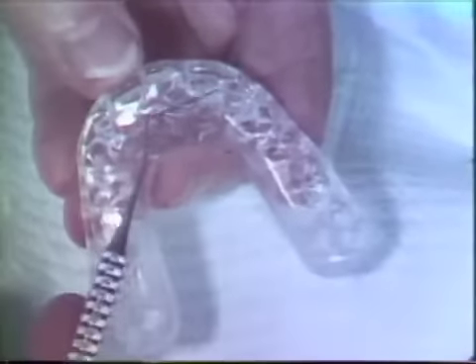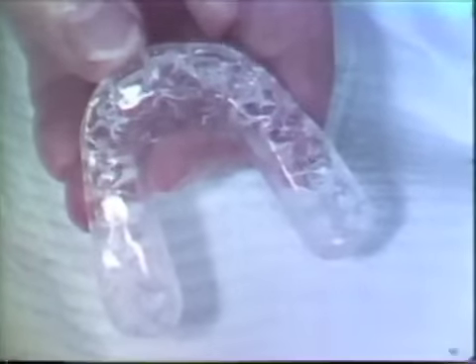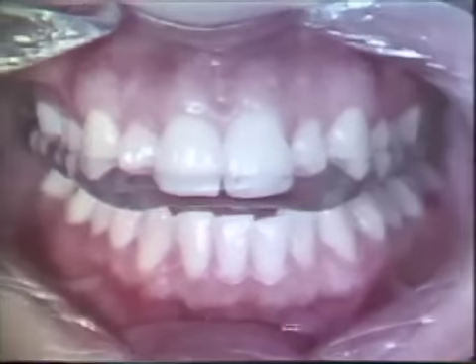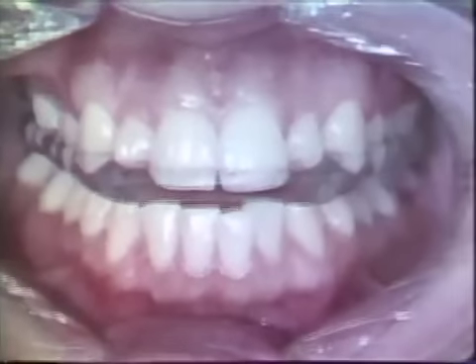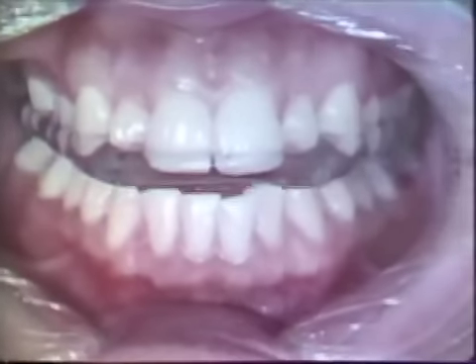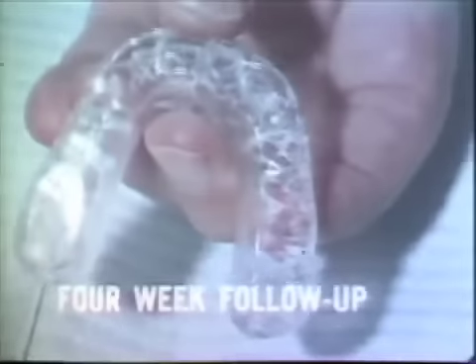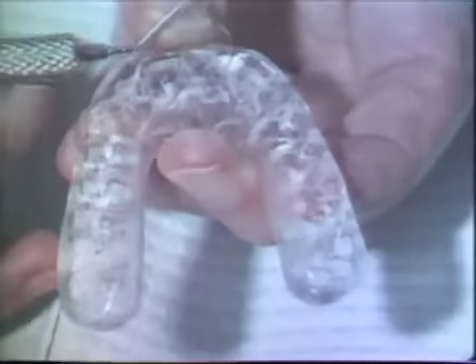The appliance has been polished and any imprints from the opposing teeth have been removed. The bite plane is tested in the mouth for smoothness of gliding movements. Notice that the jerky movement pattern observed initially has been eliminated. The patient will have to be re-examined in three to four weeks. Any indications of wear on the bite plane or uneven contacts will require readjustment. The bite plane is inspected for evidence of wear; by allowing light to reflect from its surface, indication of any occlusal wear patterns can be seen.